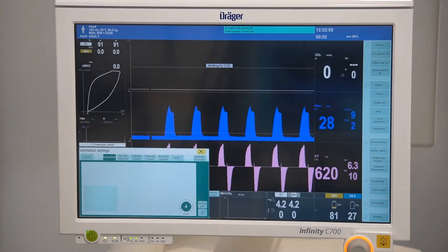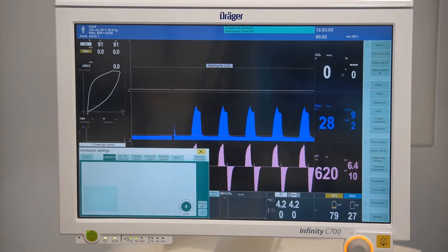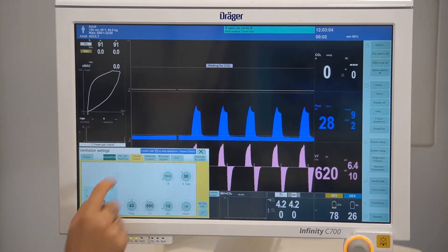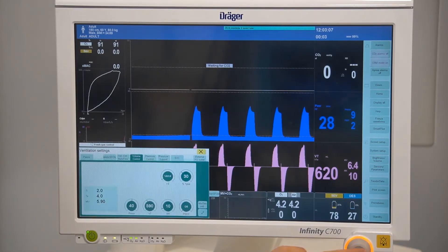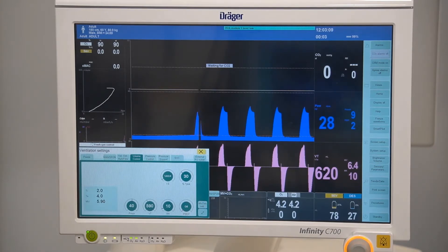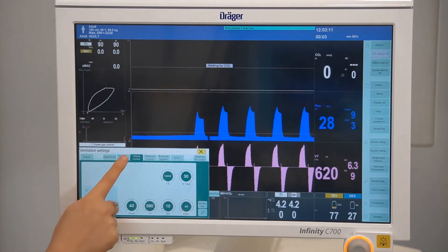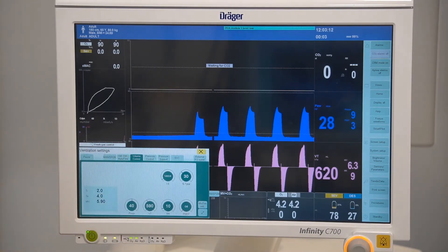To change your ventilation modes, select your desired ventilation mode from the horizontal tabs and confirm your setting. The active ventilation mode will now be dark green in colour.